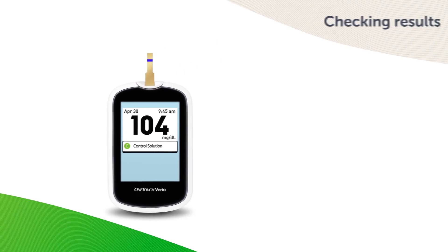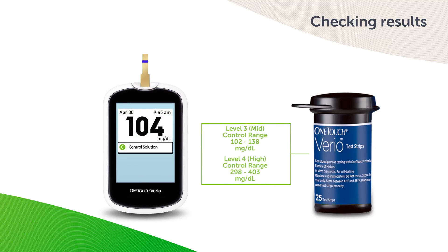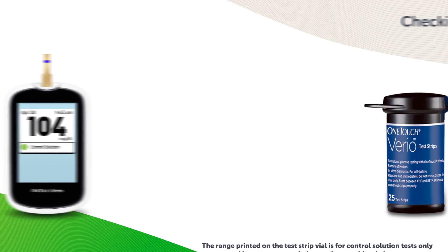Each vial of OneTouch Verio test strips has both OneTouch Verio Level 3 Control Solution and OneTouch Verio Level 4 Control Solution ranges printed on its label. Compare the result displayed on the meter to the OneTouch Verio Control Solution range printed on the test strip vial, depending on the type of control solution you used. The control solution range printed on the test strip vial is for control solution tests only and is not a recommended range for your blood glucose level. If you continue to get control solution results that fall outside the range printed on the test strip vial, do not use the meter, test strips, or control solution. Contact customer service.